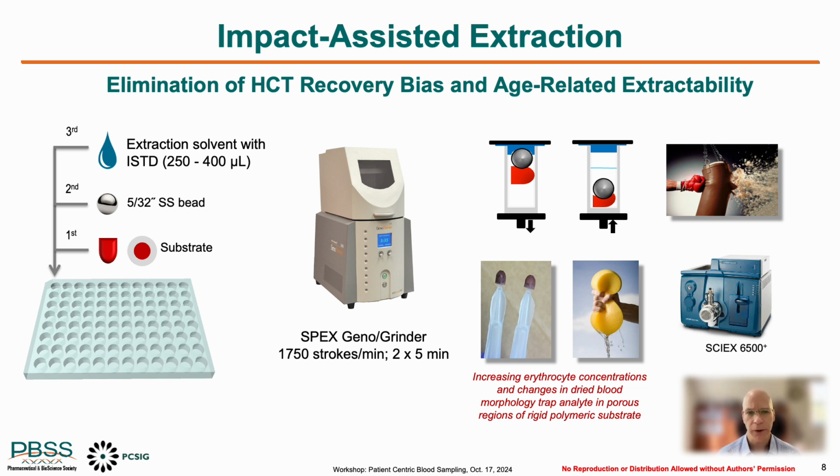a suitable collision partner. The idea is to shear away the outer dried blood layers and to further compress the substrate upon impact, resulting in analyte desorption, followed by absorption of solvent upon reformation of the tip, much like the soaking and wringing out of a sponge. And this repeated compression and reformation facilitates transport and solubilization of analyte from the porous substrate.